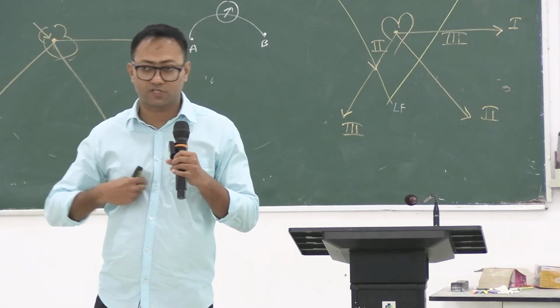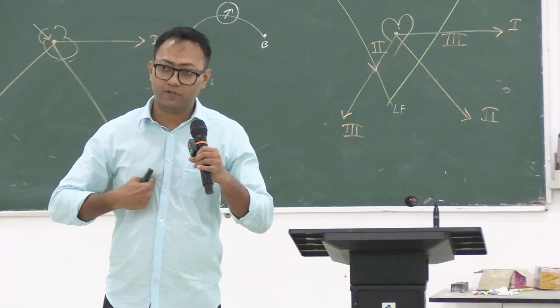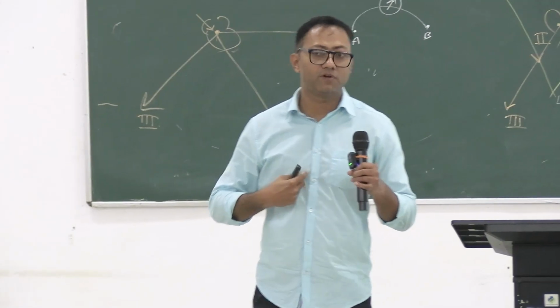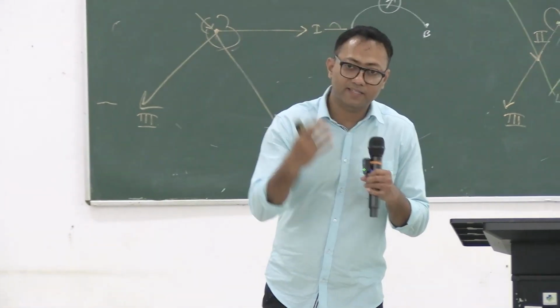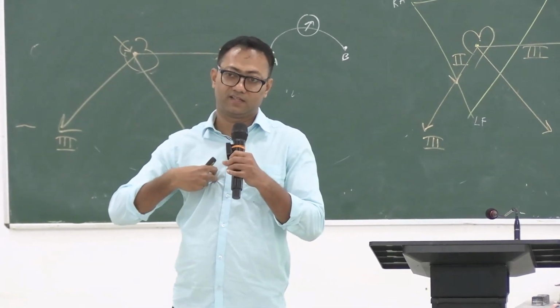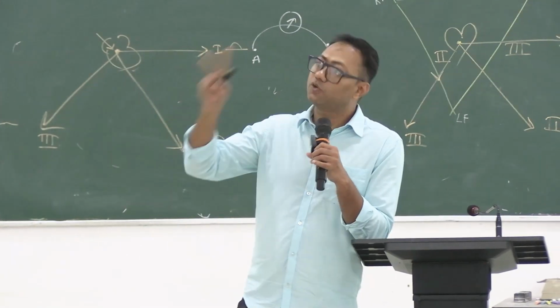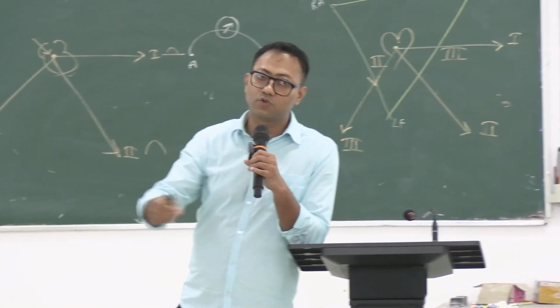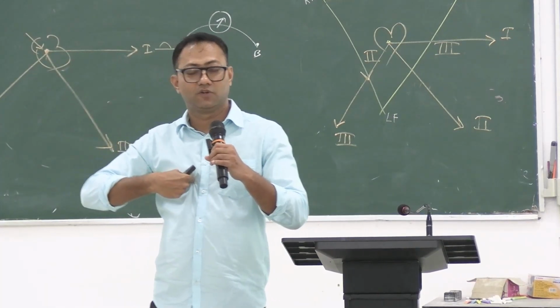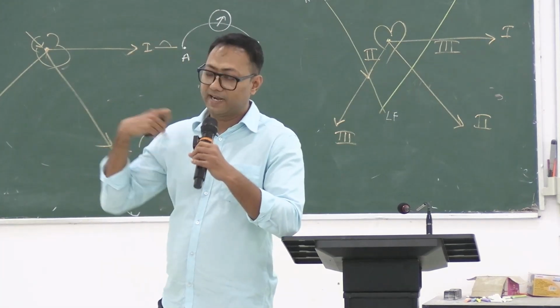just lateral to the sternum. This is the position of V1. But a lead is not a single point; a lead has 2 points, like lead 1 has RA and LA. But why for V1 only a single point? Yes, there is another point within the machine, that is the zero potential point, and it is being compared with that. So V1 also has 2 electrodes: one electrode is at zero potential and the other is this point, just like lead 1 which measures potential difference between right arm and left arm.